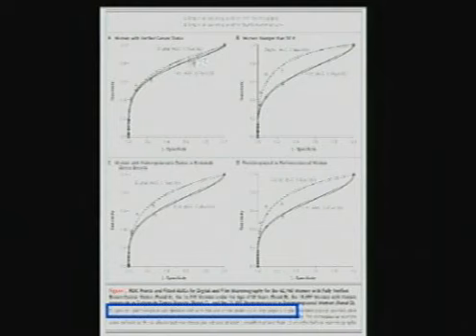Here, the dashed line is the digital performance and the solid line is the screen film performance. This is the overall cohort where you can see that there was basically no difference in the ROC performance of the interpreters.